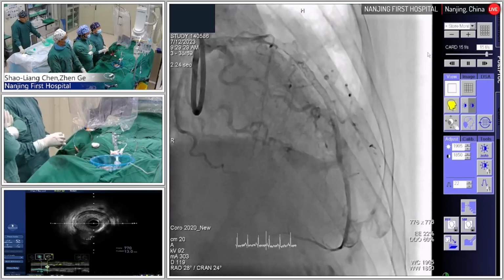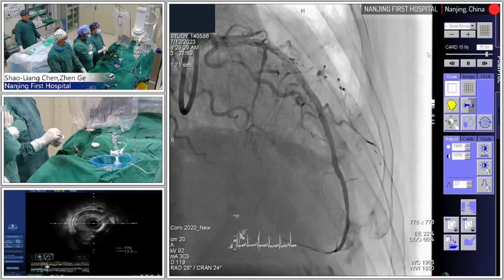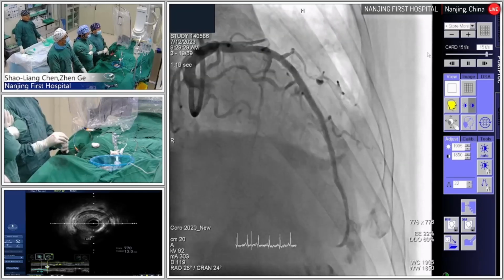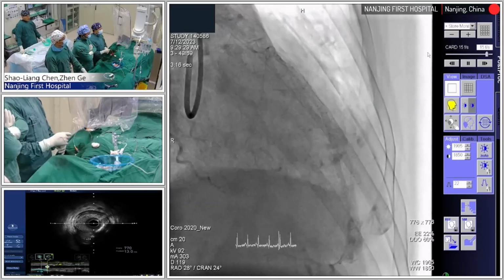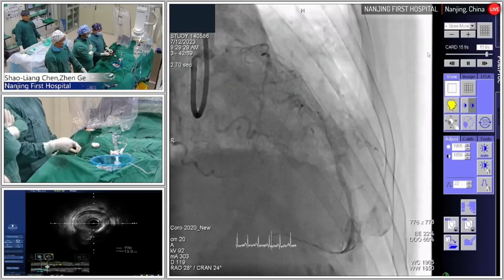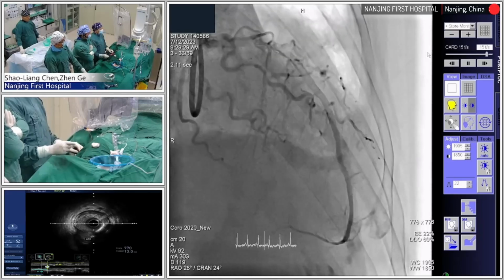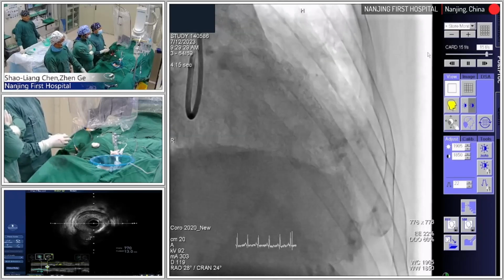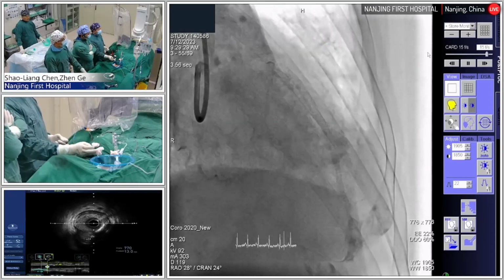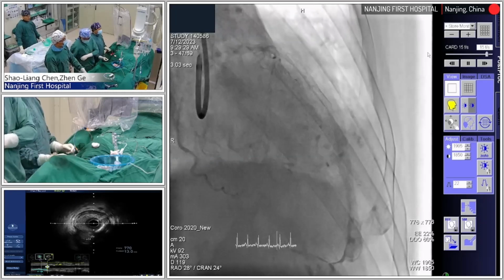So also in terms of the study trial, after primary PCI, for the non-culprit vessel, we need to calculate the QFR. If QFR is less than 0.8 in the non-culprit vessel, we need to randomize the patient into two groups. From the baseline angiography just after primary PCI, the QFR for the proximal circumflex was only 0.65.